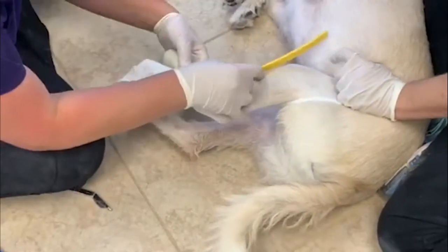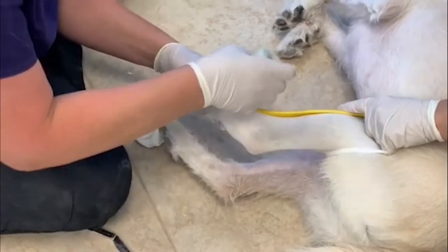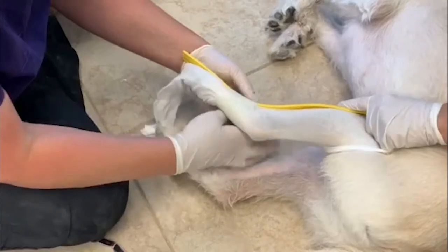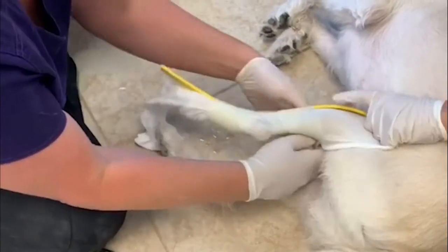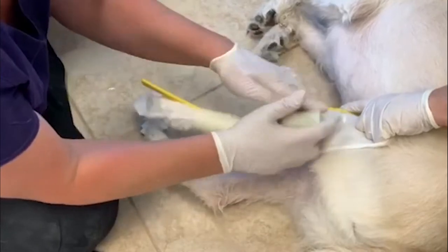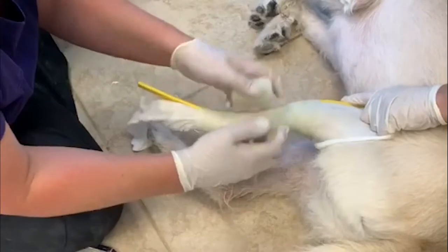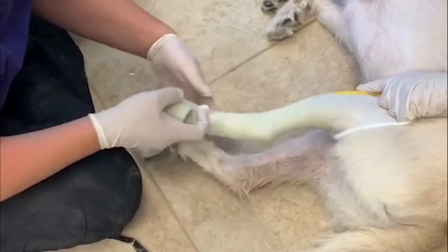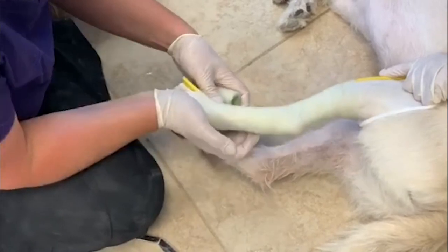The cut strip goes on the front. Your assistant helps hold the cut strip. I like to start at the bottom and lock everything in place. You want to go up almost to the knee if you can, then roll it back down. Don't go too tightly around the paw — you want to leave room for it to spread when they stand.